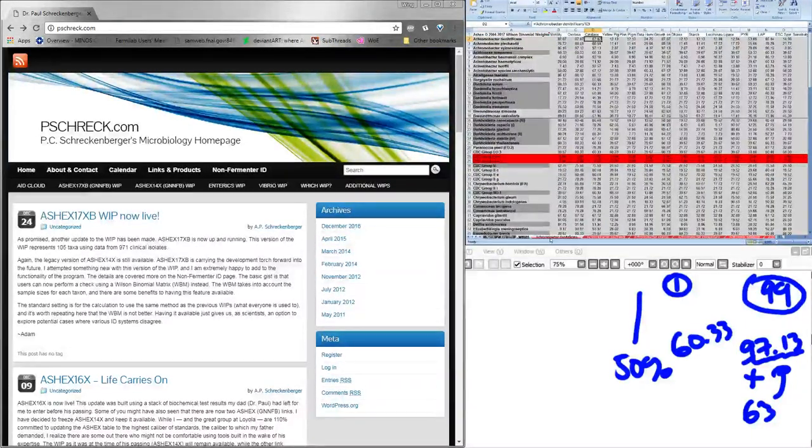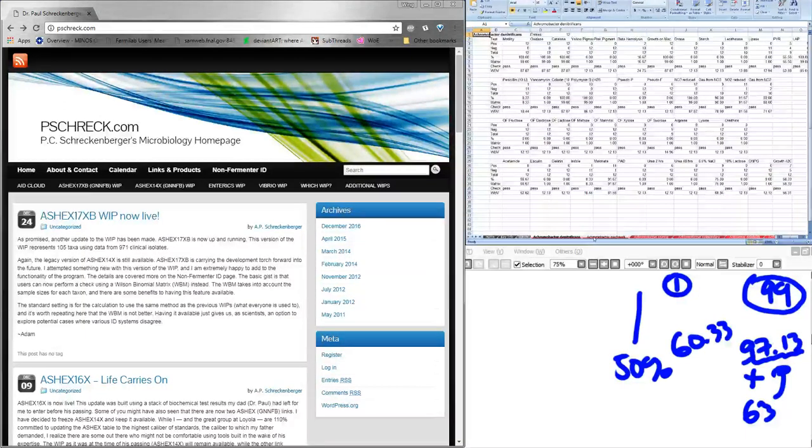You also get all of those tabs, which I poked into earlier, which give you the raw data itself: how many actual positive and negative test results were recorded for these organisms. I was really big on that when I started this in high school, and it kind of stuck with me. So there it is. It's been maintained. I hope people find it useful still.